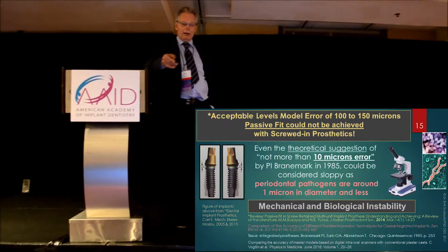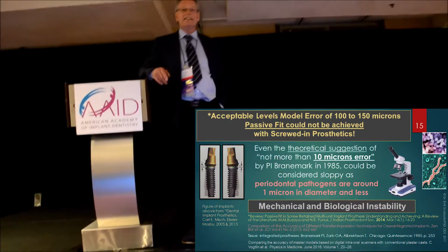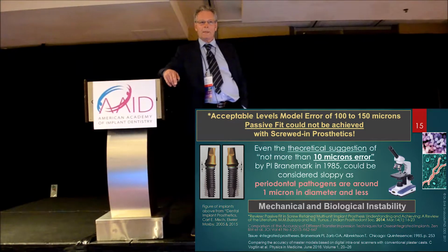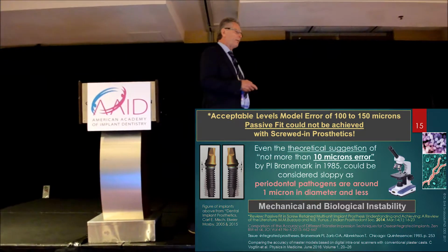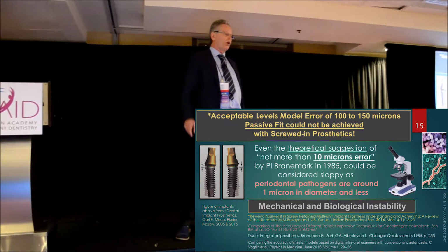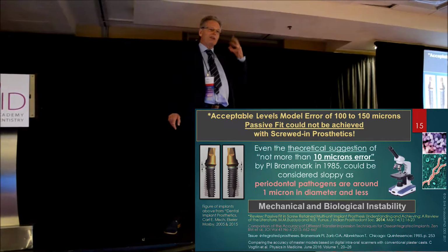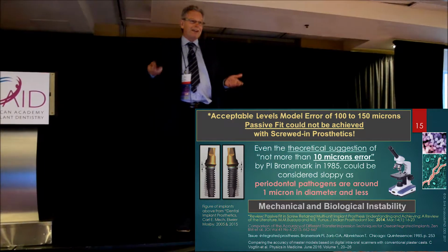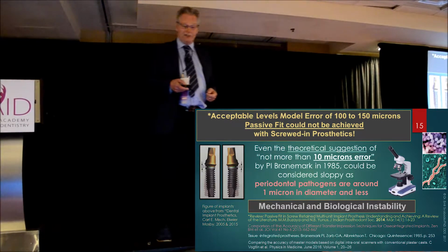Brånemark was thinking about this in 1985 already. Carl Misch was all over it, but from the point of view of the biomechanics, the pressure on the bone causing bone resorption. That was his main thing, because that was maybe easier for him, as he liked to study bone compression and stress.